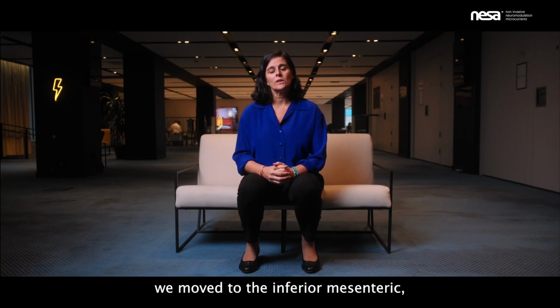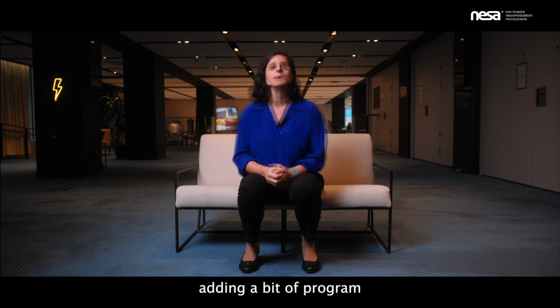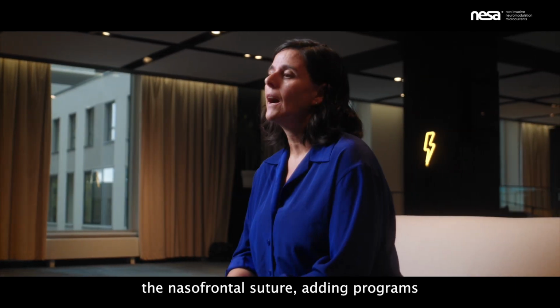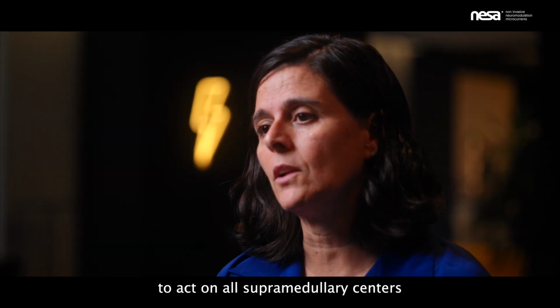After 4 more sessions, we moved to the inferior mesenteric, going down towards the suprapubic, adding a bit of program 2 and a lot of program 7. 6 sessions later, we moved to the nasion, the nasofrontal suture, adding programs 2 and 7 to act on all supramedullary centers related to the bladder.